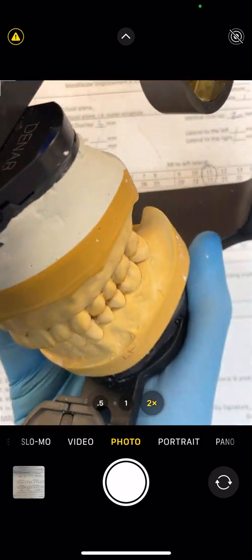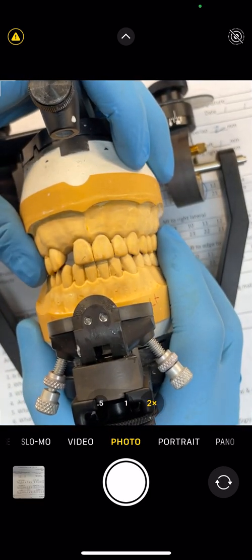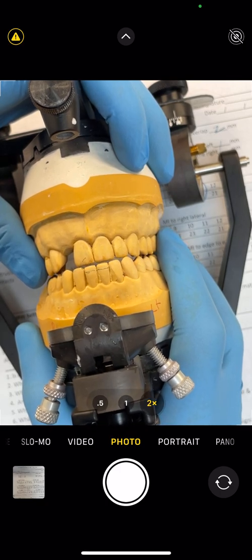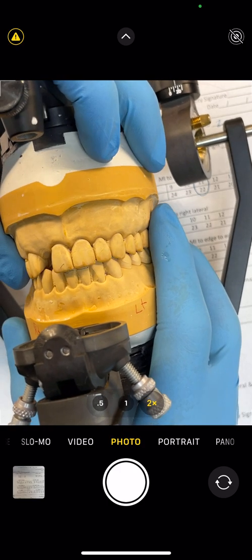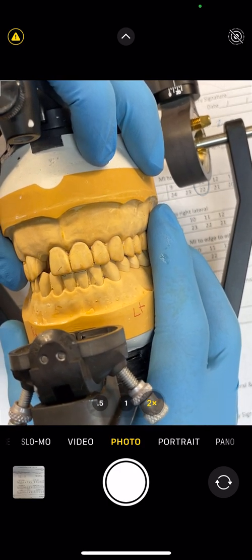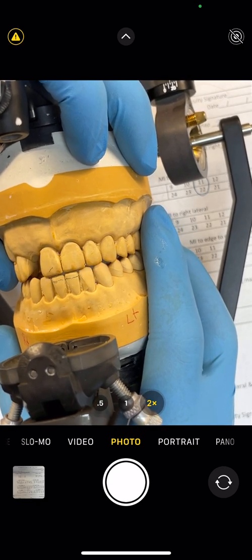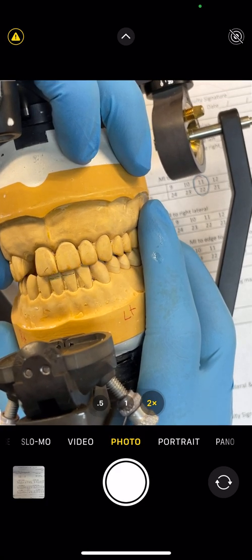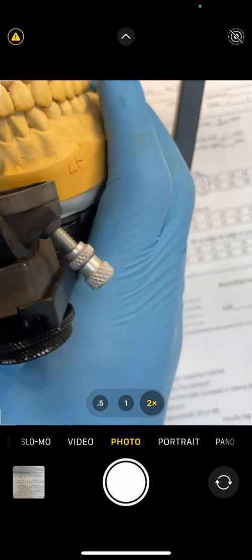Protrusive contact: you hold the articulator like that, and push with both hands. Keep the midline over the midline. So it's a journey, you have to see the journey. Numbers 23 and 24 are contributing as well with 8 and 9, and number 10 is contributing with 22.